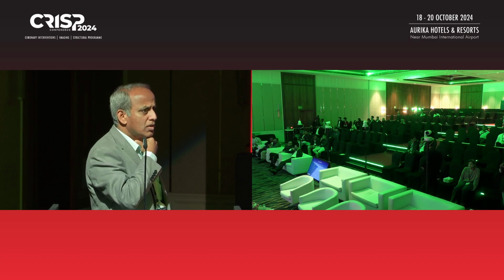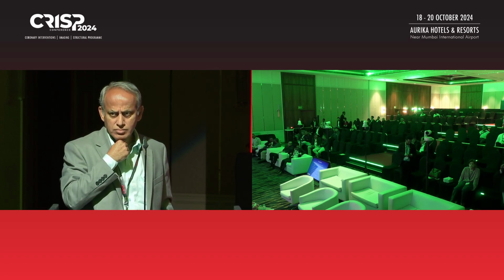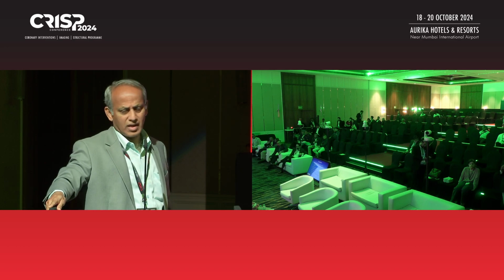In fact, two large RSOVs I had done with a muscular VSD device, too large. And both patients had hemolysis for 3 days, and after 3 days it subsided. Okay, no, I'm okay, muscular VSD device is still okay. And both the patients had a residual RVOT gradient of around 12 millimeters of mercury.